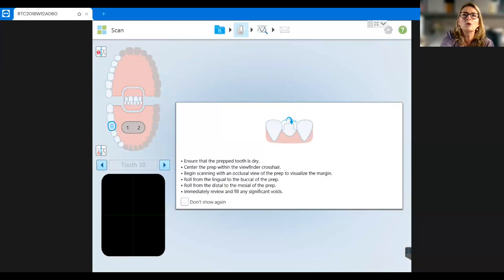I'm going to come back to that, Dr. Lupp, in regards to communications with the iTero scanner and identifying things. So sorry, I do not see the black line you're referring to. Yes, I can show that to you again.